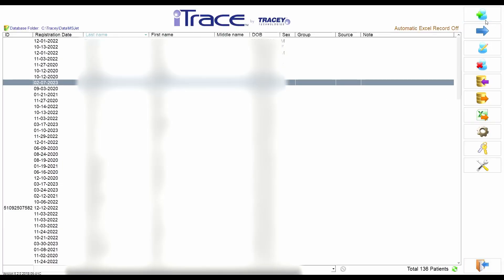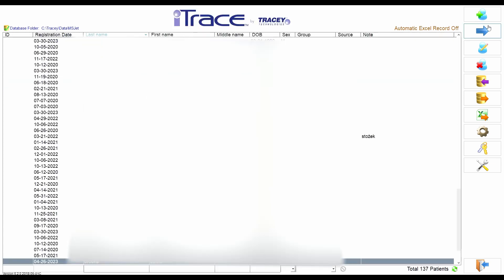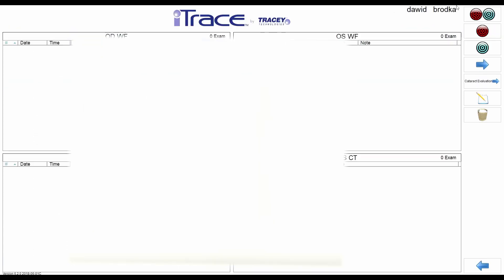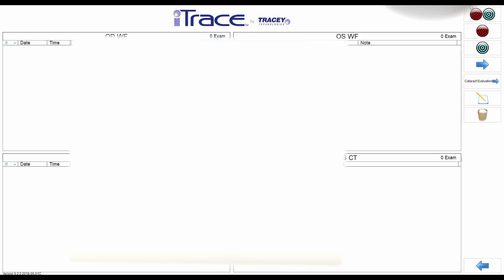This is the database window where you can see the date of examination and the name of the patient. You can add a patient by clicking the plus button, then start the examination or see the images — it's super simple. Clicking the right arrow shows past examinations, and you can start any one. There are different types of examinations: icons for corneal topography, wavefront analysis, or both.